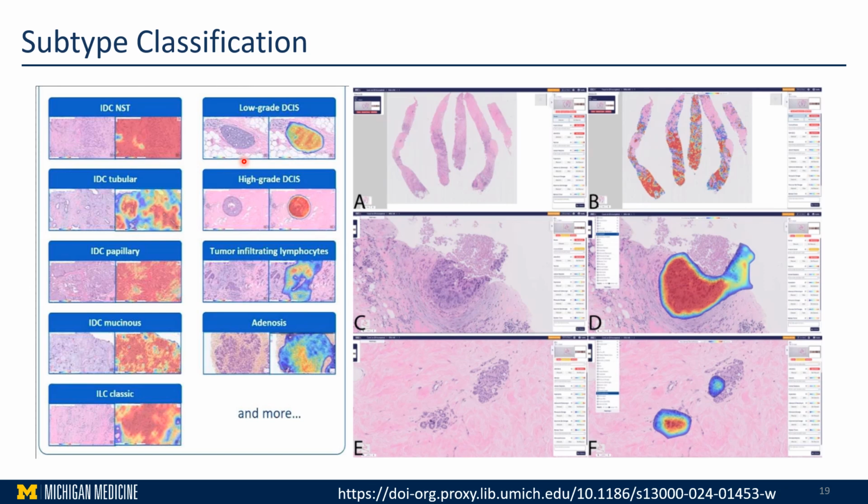So, besides tumor detection and grading, cancer subtyping is essential for delivering specific prognostic information. Several commercial tools are available that claim to classify invasive carcinoma subtypes and grade DCIS, along with additional features to enhance reporting of breast pathology to patients.